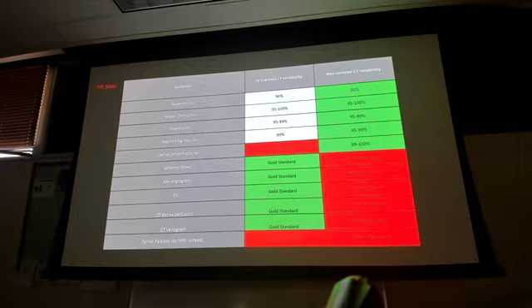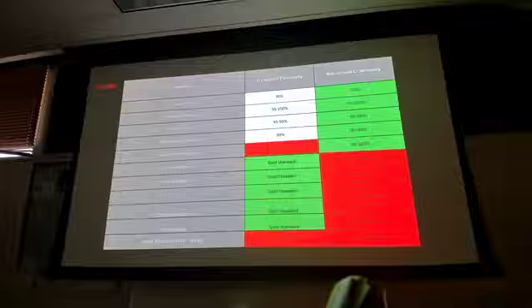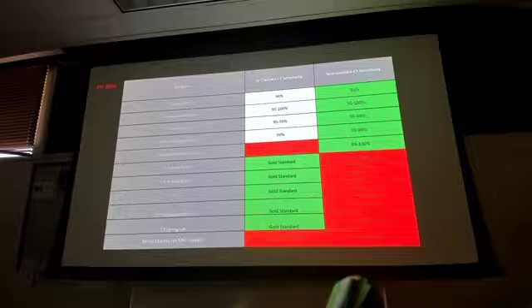Because when you're deciding, do I order IV contrast or non-contrast, depending what I'm looking for, green is go ahead and do it. Red is it's not going to benefit you in any way really, it's very minimal benefit. And the white is kind of like, yeah, you could technically do IV for some of this other stuff, but you don't have to. And again, this will help you when you're seeing those patients and going back to give a report to your preceptor. Be like, hey, this is what I want to do and this is why I want to do it. That way you know whether to use IV contrast or non-contrast CTs.